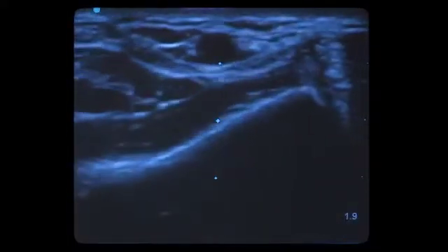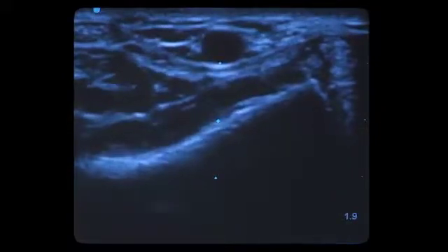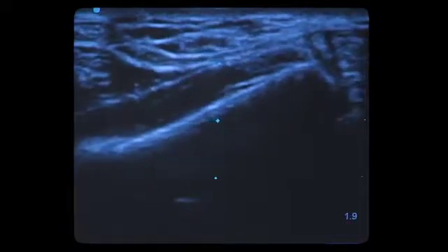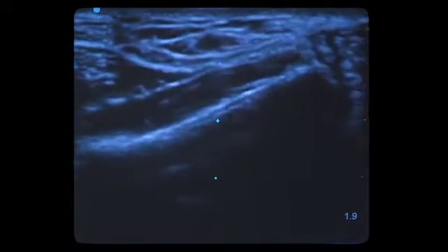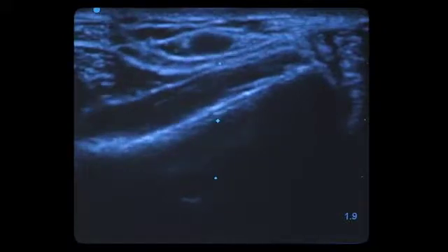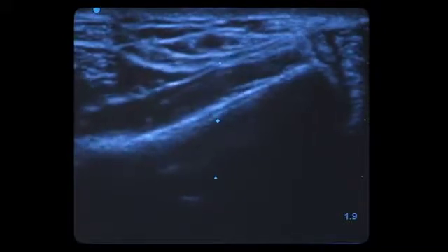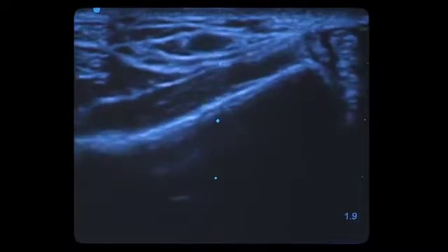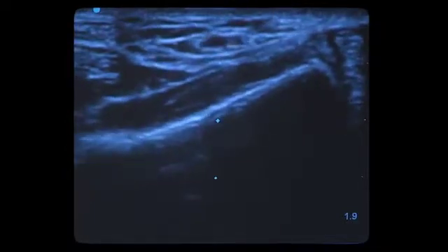The ultrasound will have two goals here. One is to demonstrate patency — in other words, your artery is open. As you can see, I'm going to hold pressure against the artery, and you can see the arteries pumping. You can see the beat of the flow into the artery really well. That shows patency. We don't necessarily need a Doppler ultrasound — just a B-mode ultrasound is enough.